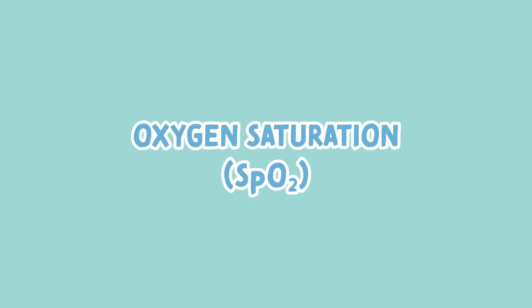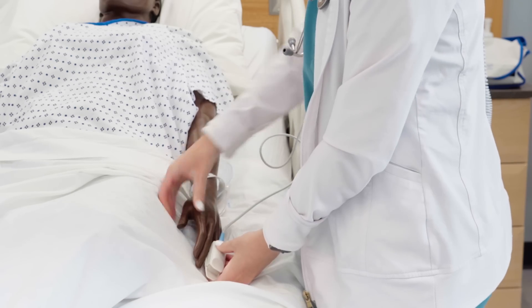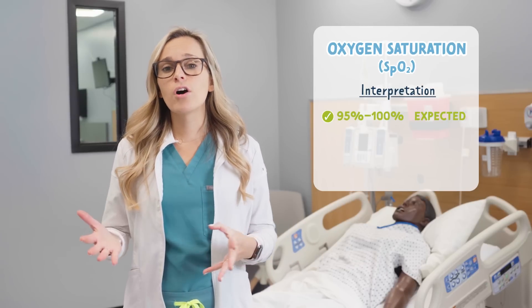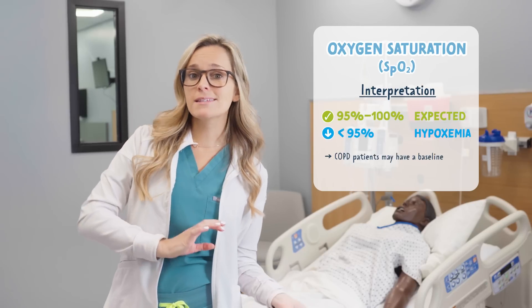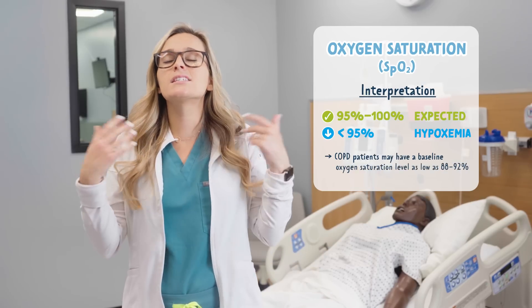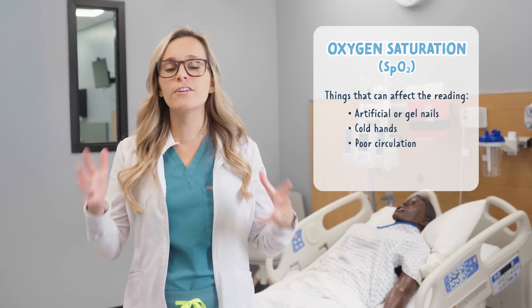Next, let's look at oxygen saturation. This is the percentage of oxygen-bound hemoglobin in the blood, measured using a pulse ox. Expected oxygen saturation is anywhere between 95 and 100 percent. If this falls below 95 percent, it's considered hypoxemia. It's important to know that COPD patients may have a baseline oxygen saturation as low as 88 to 92 percent — this is expected and normal for COPD patients. Things that can affect the pulse ox reading include artificial or gel nails, cold hands, and poor circulation.